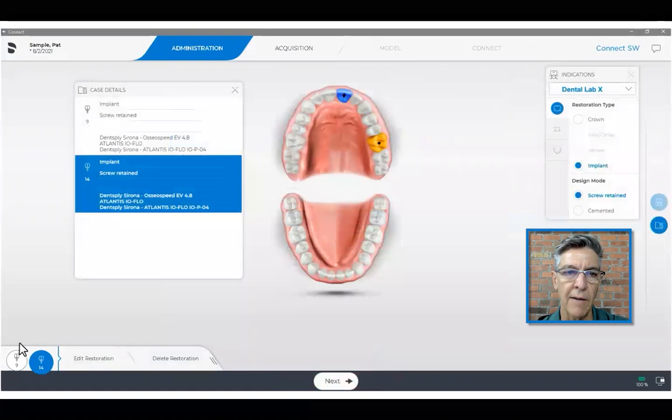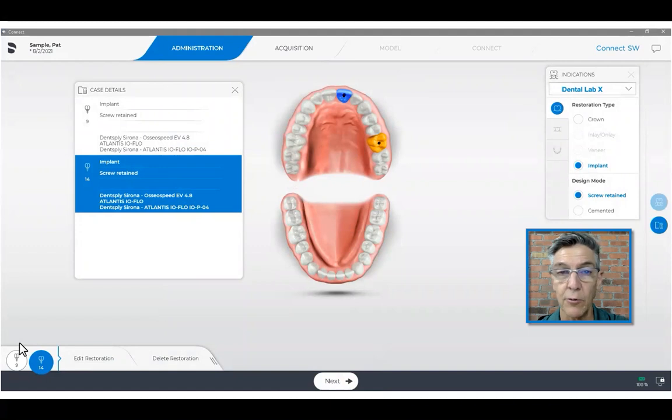We okay that, and it shows that we have selected the same scan body for both implants. This is a great feature if you have multiple implants and they're the same one, because you don't have to go through each one and register the type of scan body — you just do it one time and save a lot of time doing so.